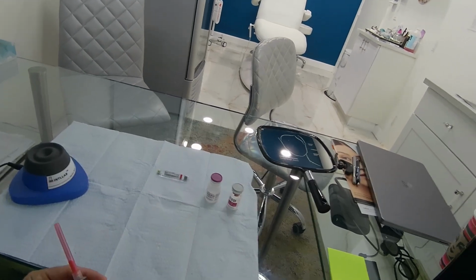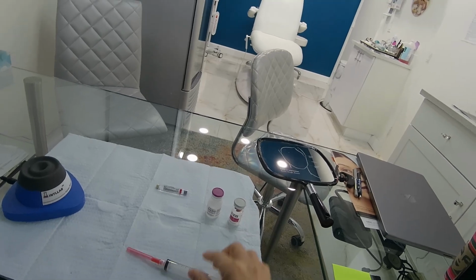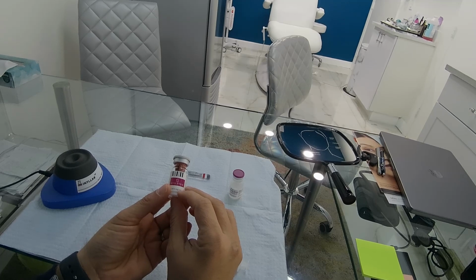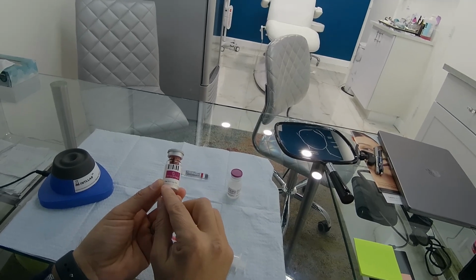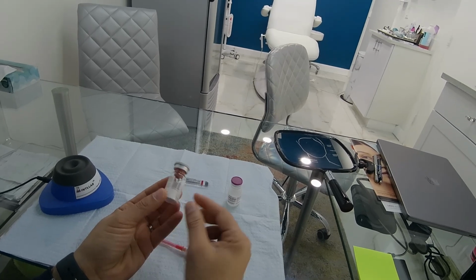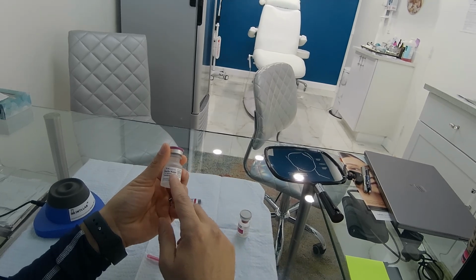Okay, so everyone, this is more or less how you will prepare Sculptra. Sculptra comes in a vial, and the vial, as you see, has a 367.5 milligram vial, and this is all the powder. So that's how it comes. The first thing we need for it is sterile water.